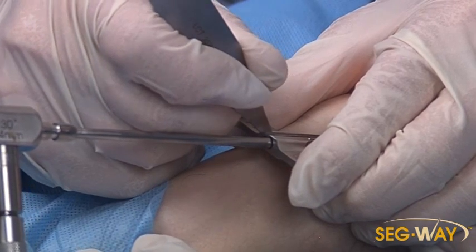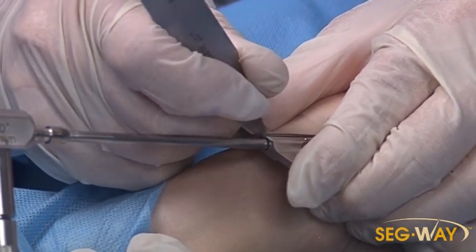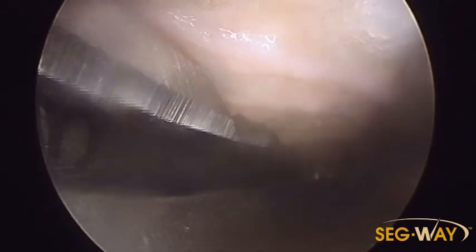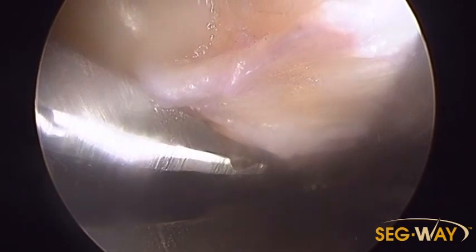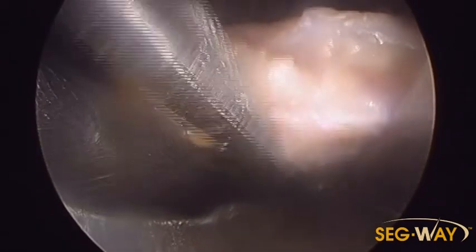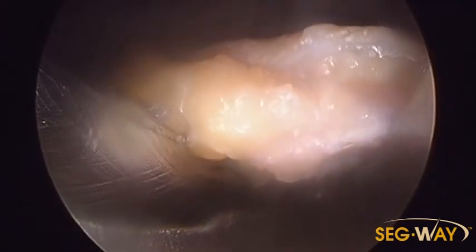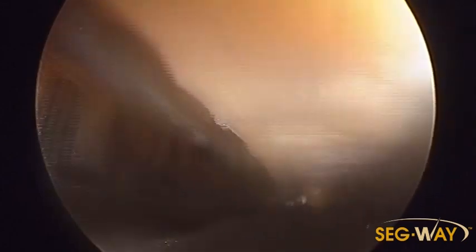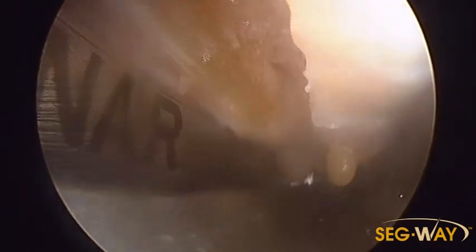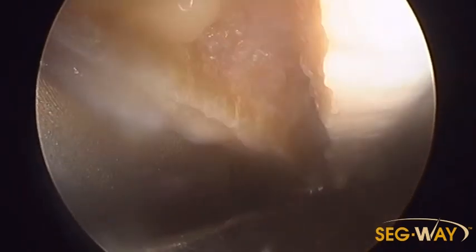I put my other hand on the guide to stabilize it so it doesn't move, then start to cut. You can hear the sound of the ligament cutting. Come back up a little, keep coming, and take it right to the edge — leave a little band there and we can take a look. There's the cut edge: completely cut all the way down. You can see both edges of the ligament as parallel lines, so you know you've completely cut the ligament.